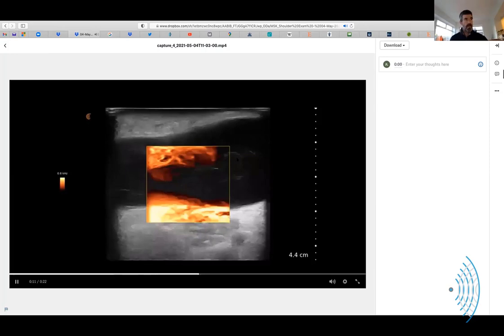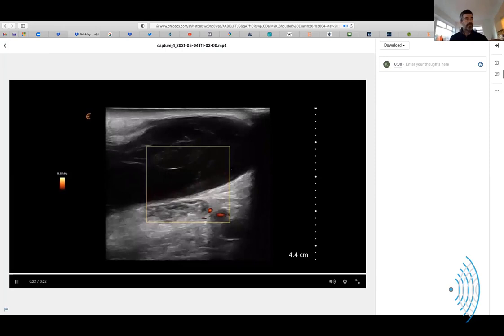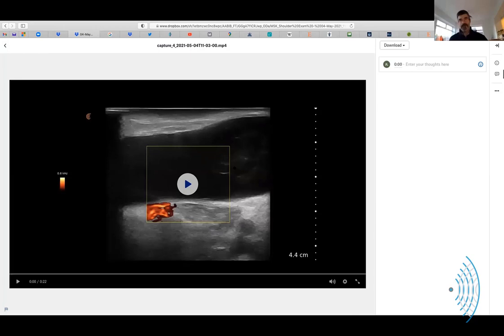But as I'm dissecting this mass, I must then do it in a grid type fashion where I simply hold it and watch and hold it and watch. And the larger I drag that box, it just seems to me like my sensitivity gets absolutely shot, especially on the little thing I have. So what you have to do, with something like this in practice, is to decide that it's mostly fluid, and look at it, and then pick out the bits that look most solid, and make sure those you scan in detail, and move the probe very slowly. It doesn't have to be stationary, but you have to be smooth. And it doesn't take very long, in actual fact.